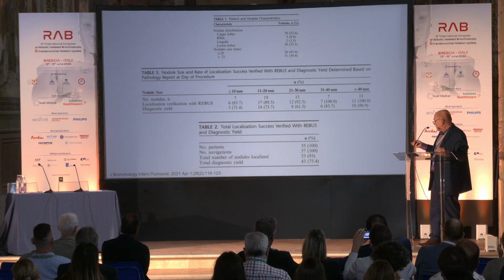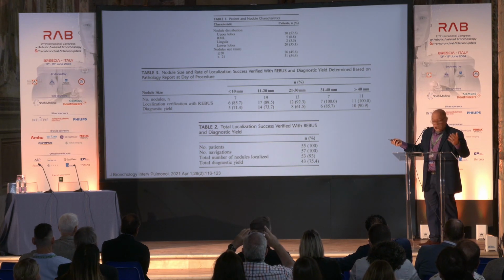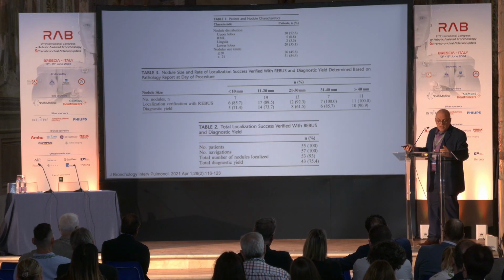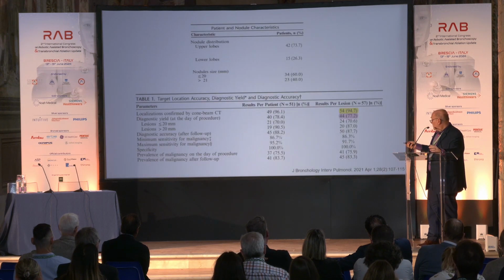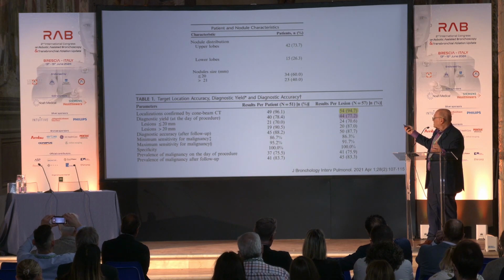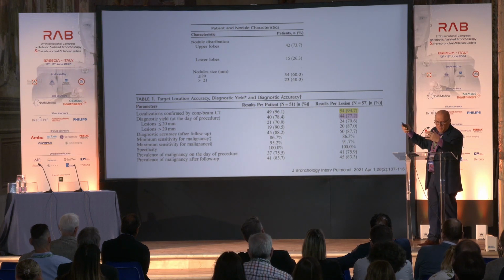The first was from Mike Pritchett's group, and he did very well, just with Body Vision and augmented fluoro. He had a yield of 75%, which is pretty good if you think about what initial robotic was without imaging. This was our data from the Cleveland Clinic, roughly the same as Mike's. Actually, this is not just Cleveland Clinic. This was 5 sites collaborating together.